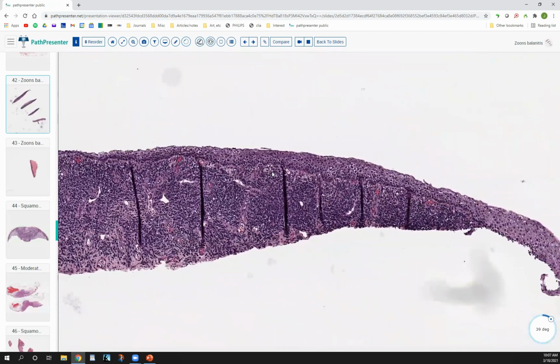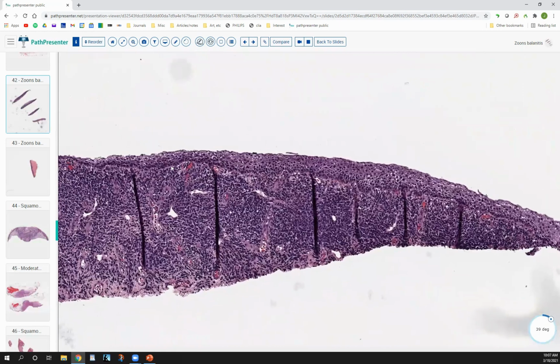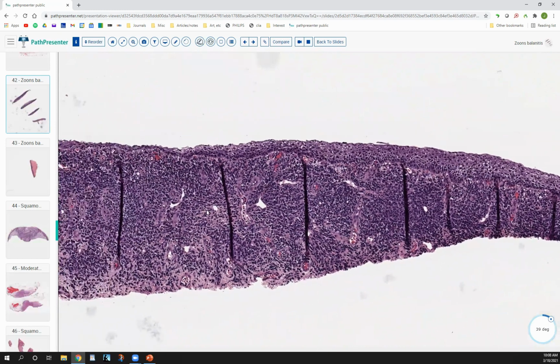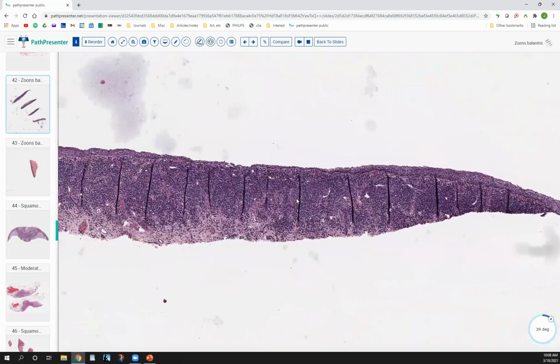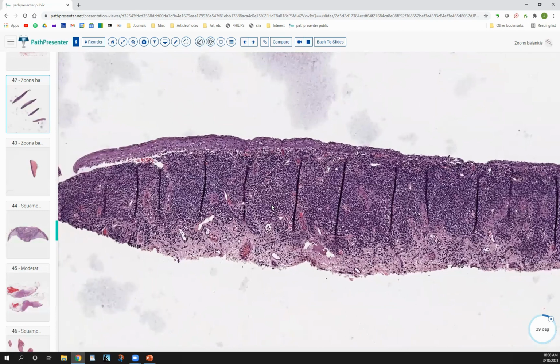But I think the important thing, a couple of things, is to recognize that it's not cancer, that's not squamous cell carcinoma in situ. You can tell that by looking at the bland epithelium, by those lozenge cells. And if you have plasma cells, you often want to think about syphilis. So you may want to correlate with the serologic studies or do a spirochete antibody stain.